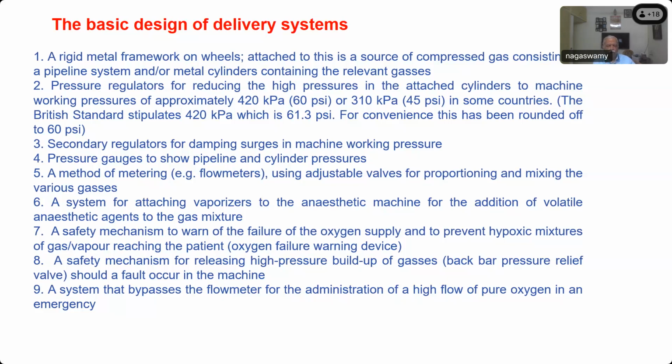If it is a short burst, okay, nothing will happen. But if you use it continuously, what can happen? It can cause barotrauma. So in order to prevent that, nowadays the oxygen flush button automatically recoils. You cannot keep it on like the older machines. Okay, self-limiting oxygen flush. It is called self-limiting.